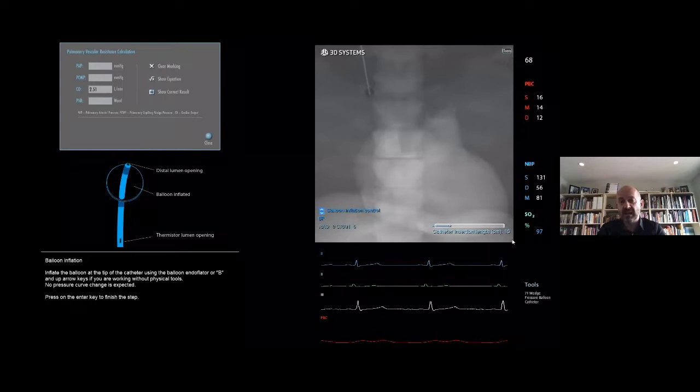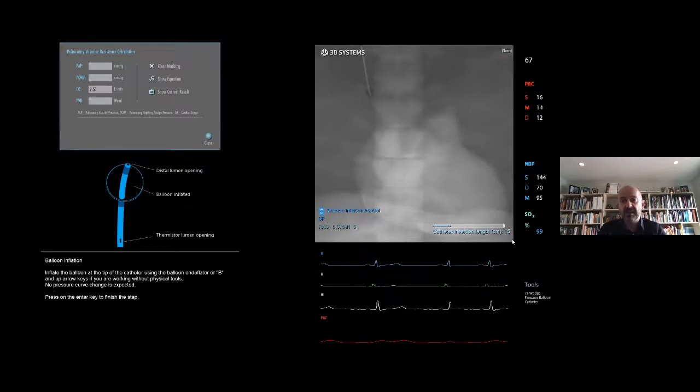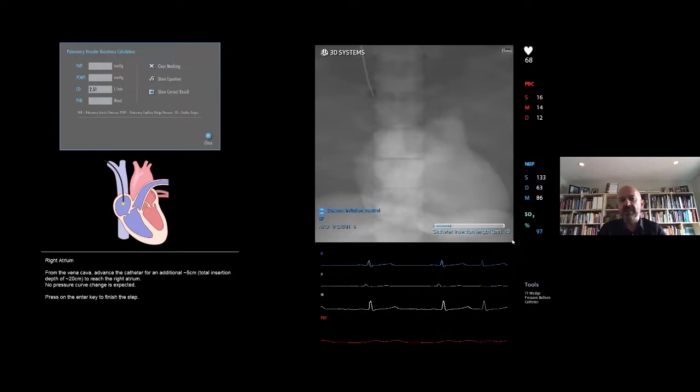You can see this on fluoroscopy. The balloon is now up. Again, you wouldn't be seeing this, but you want this because you don't want to get into the heart with a blunt catheter without visualization. These catheters can also be called balloon-tipped flow-directed catheters, and that's actually true. The balloon is helping you flow direct the catheter. I do have to say you do have to manipulate it sometimes, and the balloon is not the answer to all your manipulation issues, but it clearly does help when you're going blindly from the neck.